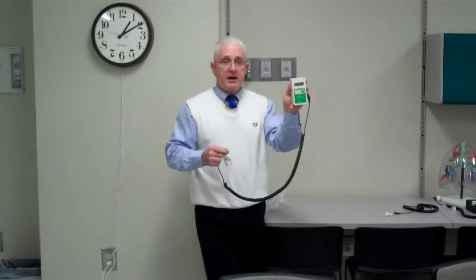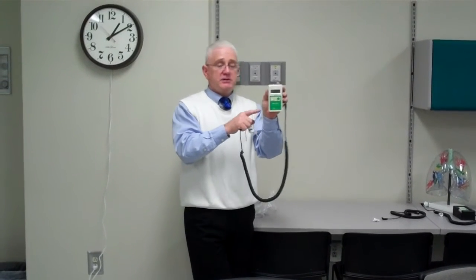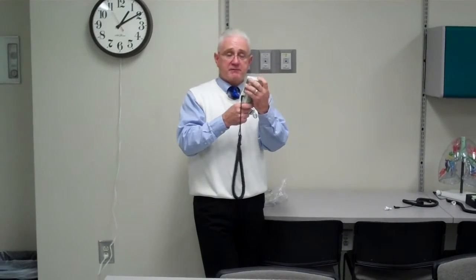You turn it on by pushing the little green button, and you're going to get a readout. It uses a 9-volt battery, and if you ever forget, on the back of the unit itself it has the instructions on how to calibrate.